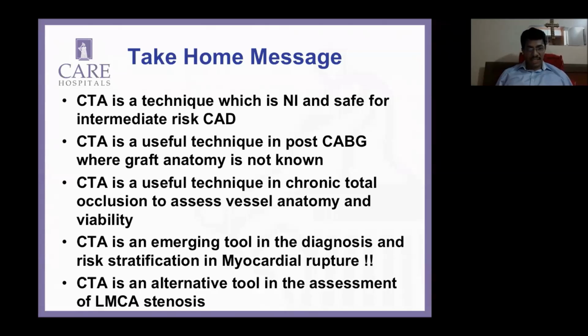And CTA is an alternative tool, obviously not the best tool, but an alternative tool if you want a cheap, non-invasive way of assessing a left main stenosis. So with this, I just want to thank you once again. And it was great presenting these cases, and I hope you liked it too.